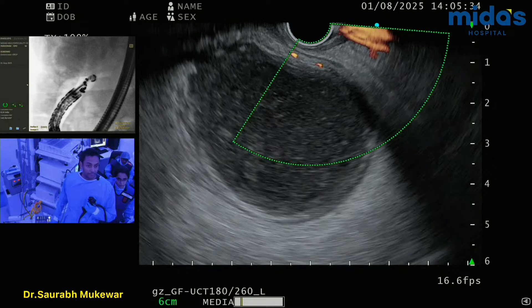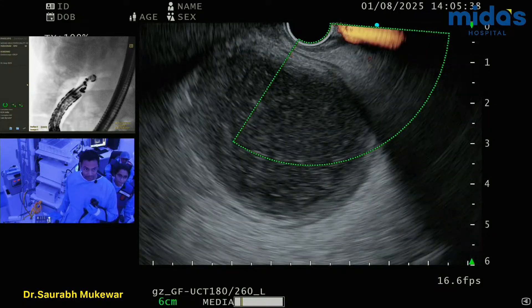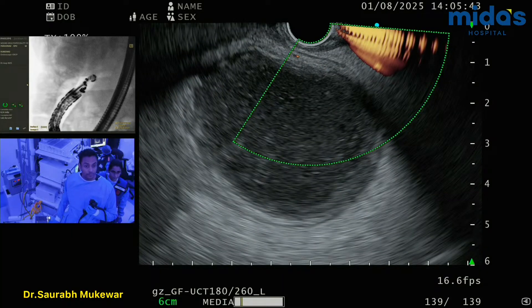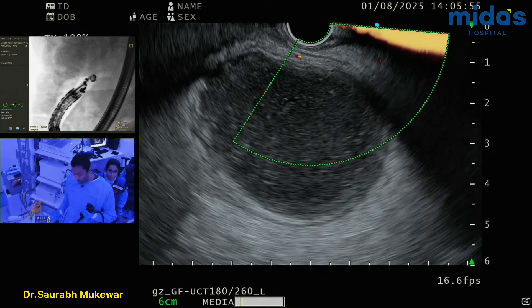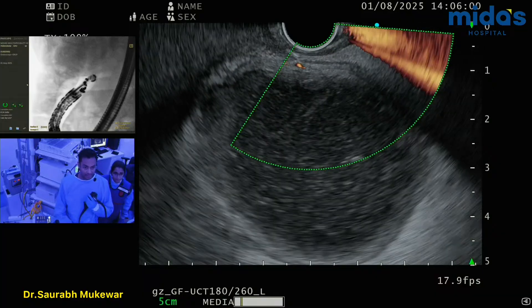Sir, how much distance do you need from the gastric wall? About one centimeter, right? Because the Axios is one centimeter in length. So let's see — this is the gastric wall, and this one here is the gallbladder wall. It's about 6.7mm. So it's not a lot, less than one centimeter. That's the second consideration.